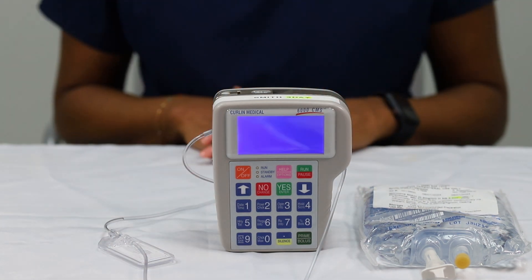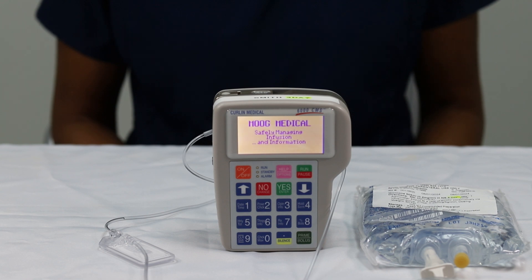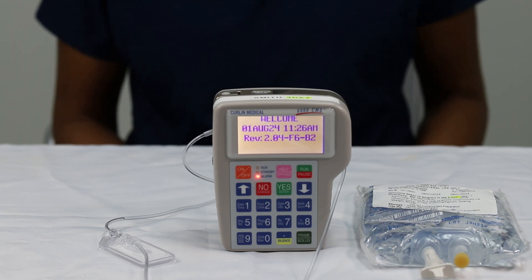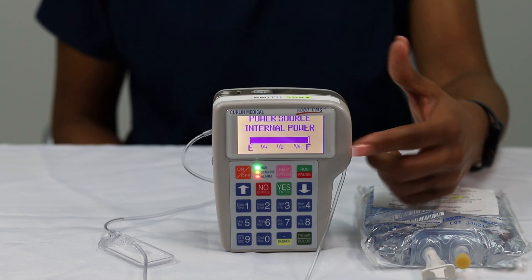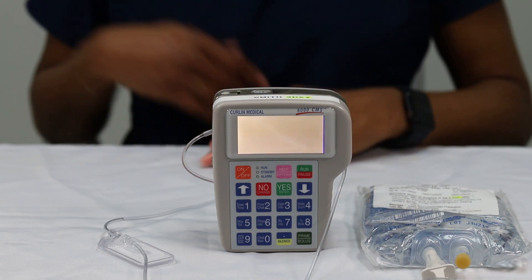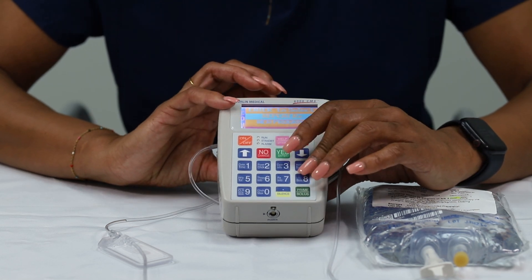You are now ready to turn your pump on. Press the orange on/off button located on the upper left side of the keypad. You will hear a series of three beeps as the pump performs a self-test. System OK will appear, and your battery strength will appear.